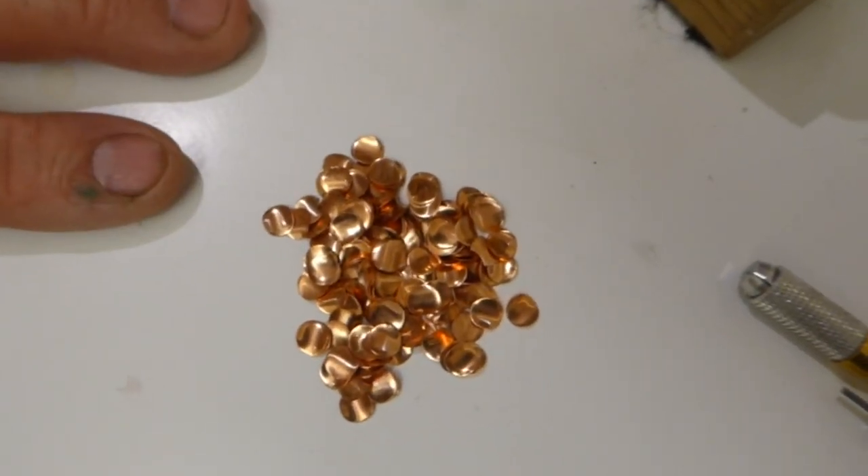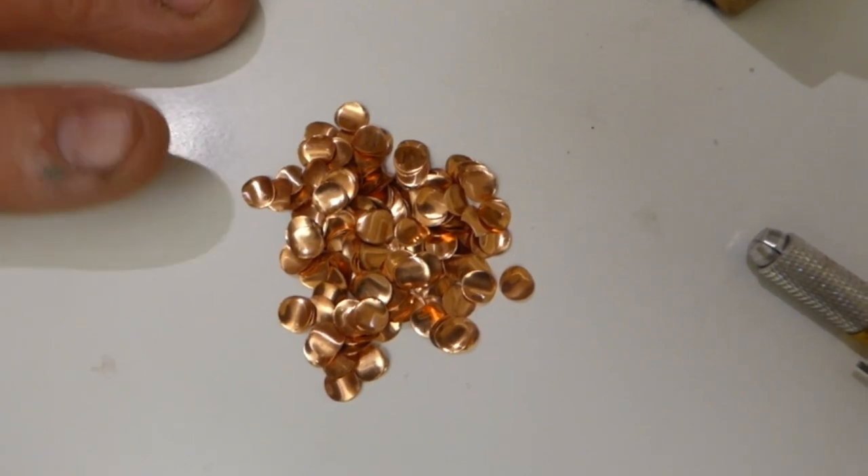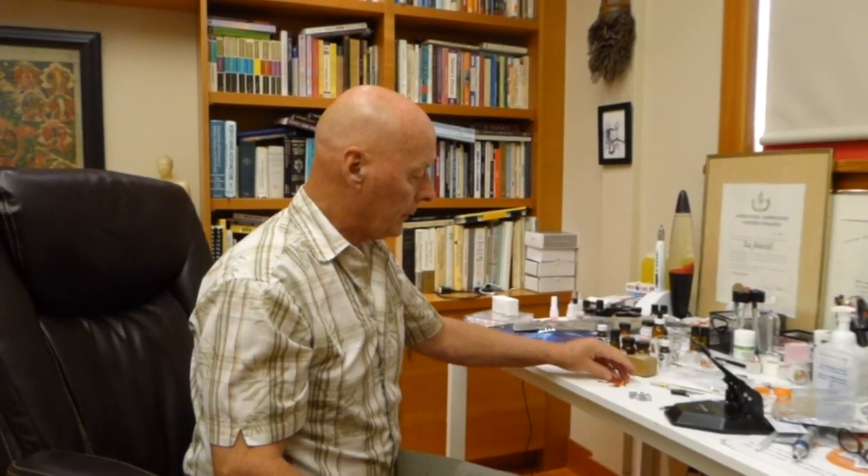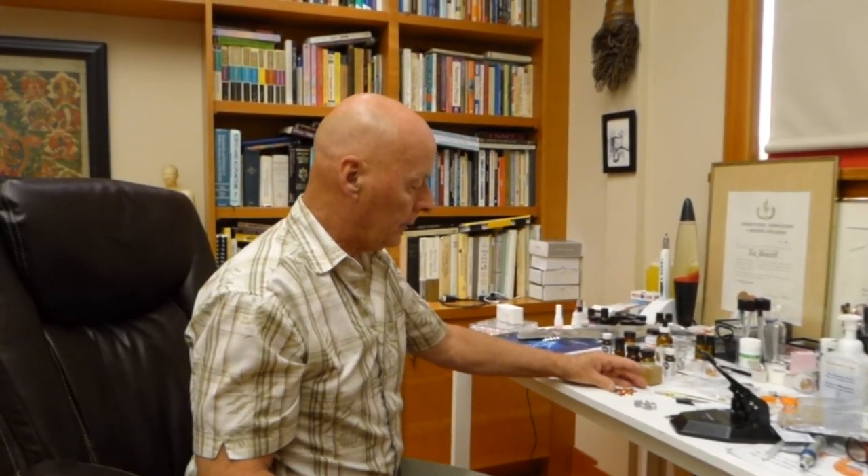I go to a certain metal supply store and I can buy very thin sheets of pure 100% copper. And again, I can do the same process. By the square footage — the first time I bought some, I bought 12 square feet of copper sheeting, and I would cut off about a square foot and then just do the same process. Just put it through and create these beautiful, inexpensive copper and aluminum electrodes.